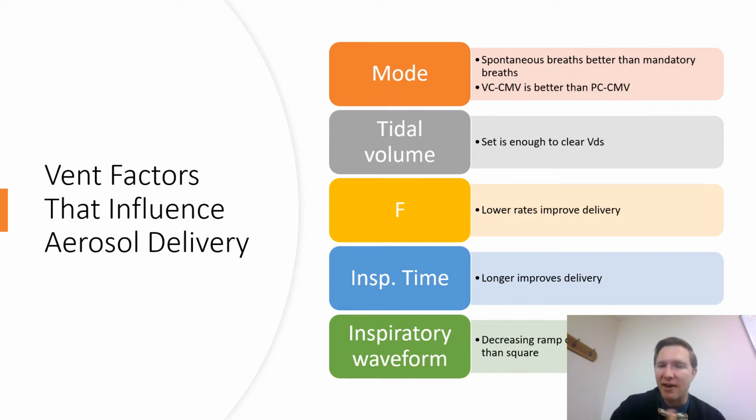Why do you ask that, right? Why is that better, right, Derek? If my patient is in a spontaneous mode where they're triggering the breaths, or a pressure support mode where the patient is doing most of that work, why is that better than if the machine's forcing the gas in? Well, this goes back to the physiology of breathing: when you breathe, you're using your diaphragm to pull gas in. You're using negative pressure. When you're using negative pressure, you have more even gas distribution throughout your lung regions.